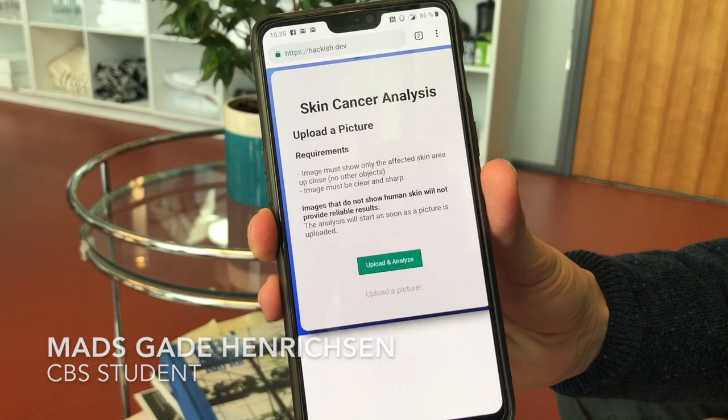This website is called hackish.dev and it's a skin cancer analysis application. There are some requirements for the picture you upload — the image can only show the affected skin, so the skin lesion or the mole, and the image must be clear and sharp.